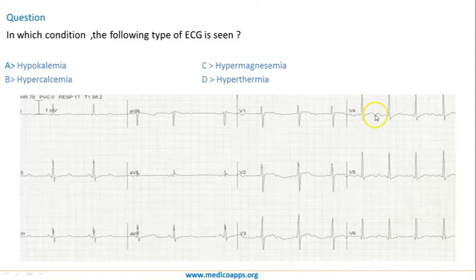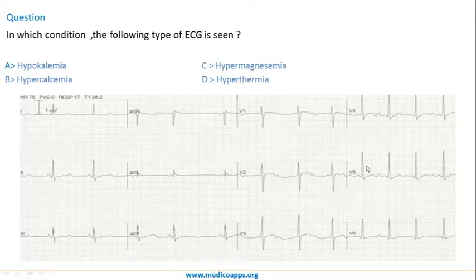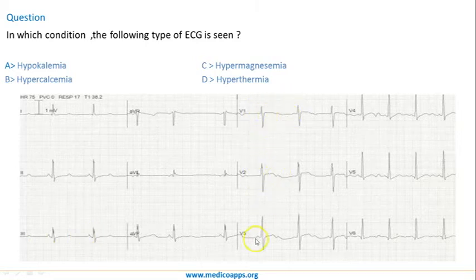Again, if you measure here from 1 to 2, it's almost 13 to 14 small squares, so definitely there is an increased QT interval. The ST segment is isoelectric in all the leads.